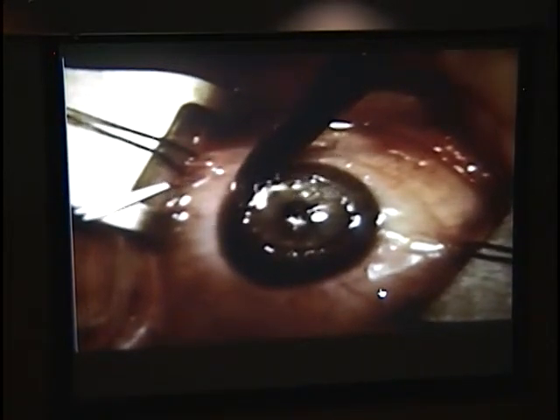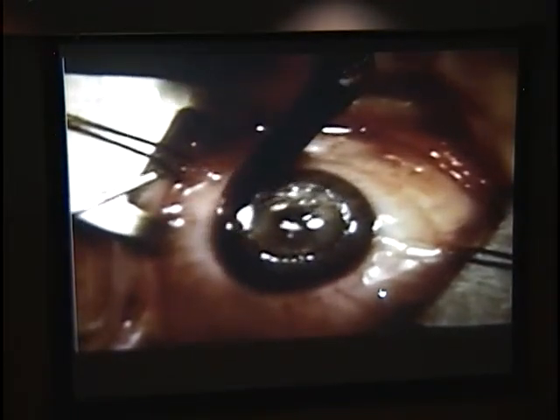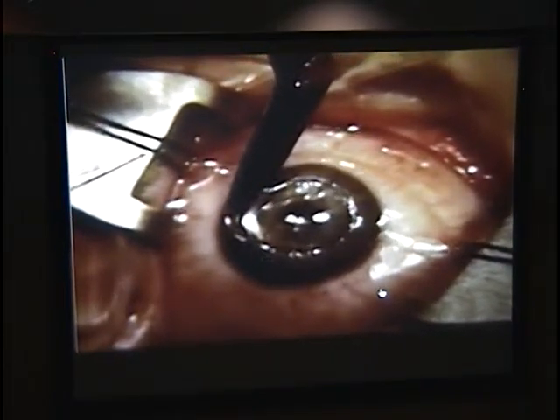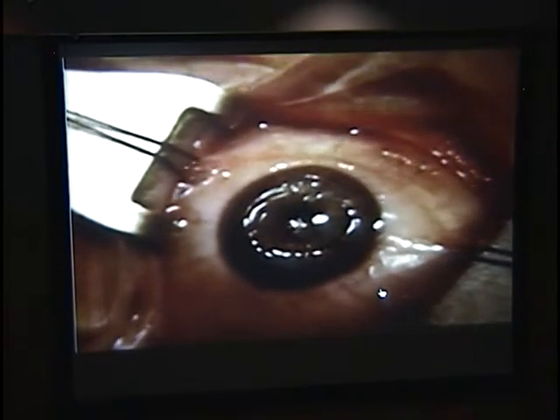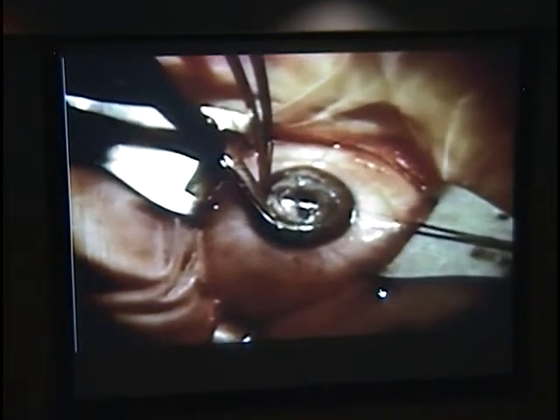The Hildreth cautery marks are further from the actual trephine cut than they were from the original trephine mark. This shows how an extra crescentic wedge of anterior corneal collagen is drawn into the button to be discarded from the patient's cornea. The ultimate effect here is like putting a round graft into a site with an oval anterior opening and a round posterior opening.